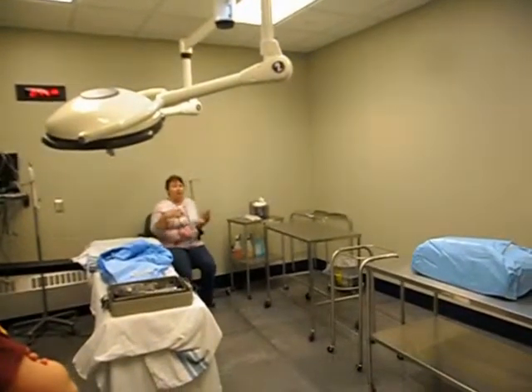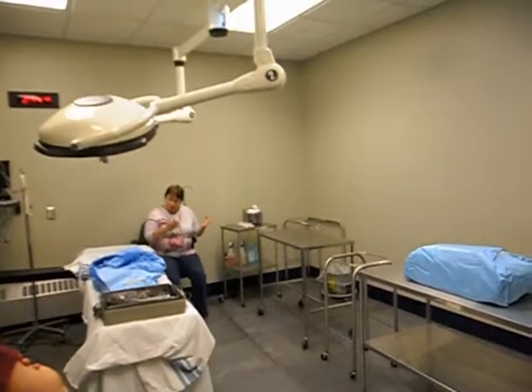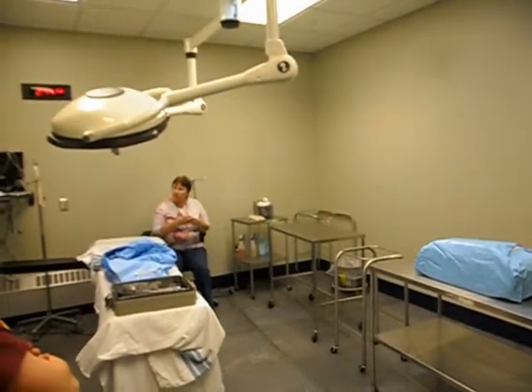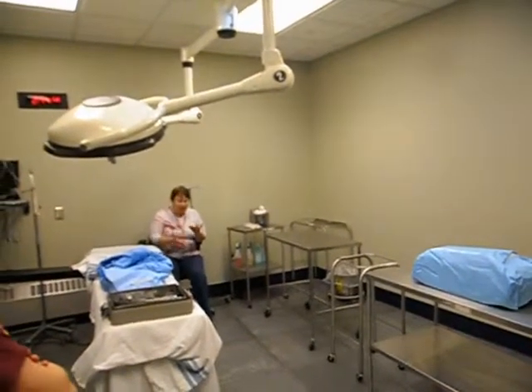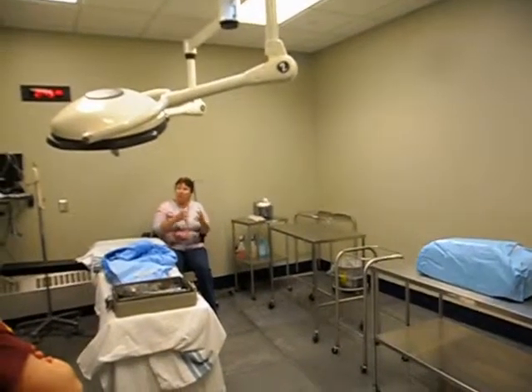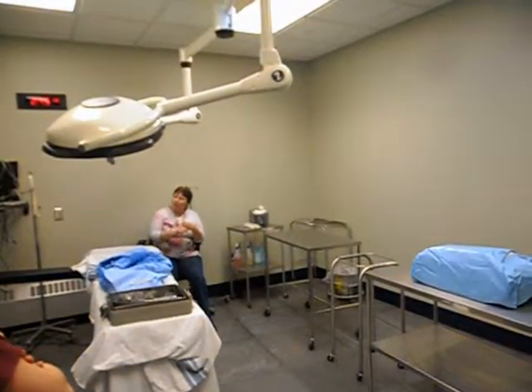Now, if we were thinking about this, let's say this was an abdominal aortic aneurysm repair. What I'm trying to get at is the instrumentation and the equipment to get in the laparotomy approach is the same. That doesn't change. You still need a lot of the same equipment. You still need light handles. You still need suction. You still need longs and laps, and you still need gowns and gloves and such. But once you get into that abdominal cavity, depending upon the type of case you do, the instrumentation, equipment, and meds change.